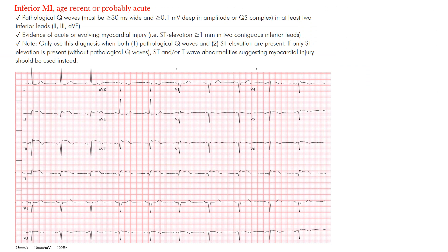So, acute inferior MI — let's get started. When we say inferior MI, age recent or probably acute, we think this inferior myocardial infarction is likely in the acute setting. What do we see on the EKG? There are a few things we're going to look for. We're going to look for pathological Q waves, and the other key finding is ST segment elevation. You want both of those, because if you just had the pathological Q waves, we would say that is likely an older, age-indeterminate inferior MI.